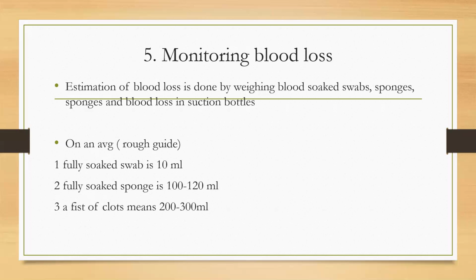Monitoring of blood loss is very important in anesthesia, or in any patient undergoing a major surgery, or any geriatric or pediatric patient, as hemodynamic assessment, or major changes in blood pressure or pulse volume, can only be estimated by using blood loss monitoring.